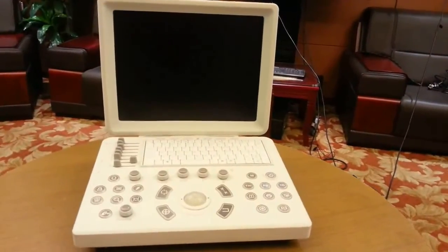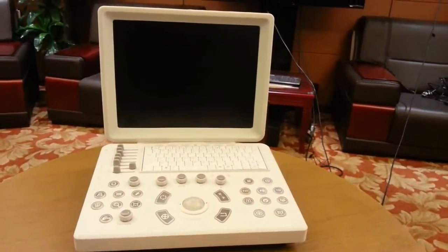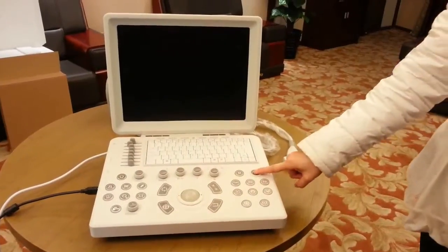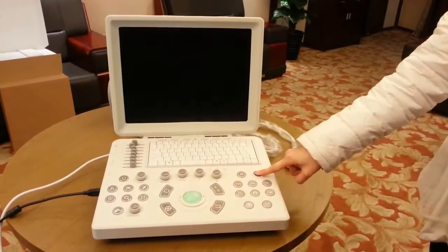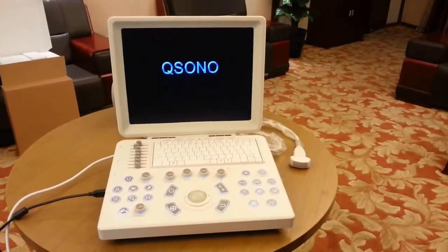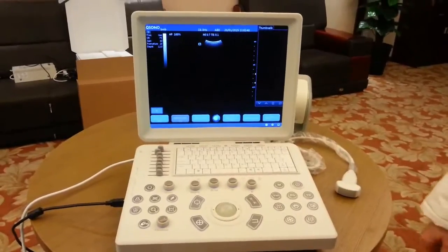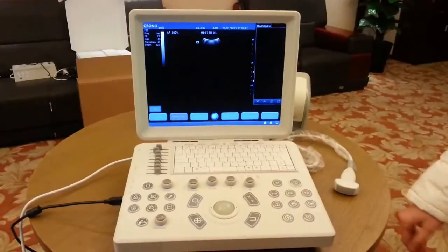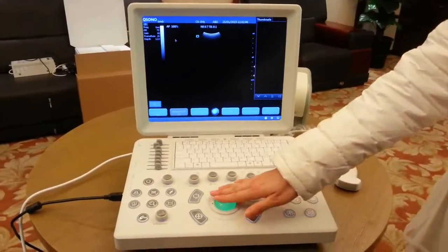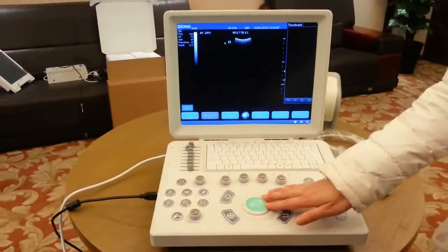Now we connect the power cable and the probe, then press the power button. It will take a few moments to boot up. In the following operation, the words 'select' and 'click' mean: use the trackball to move the cursor to a location and press the set button.